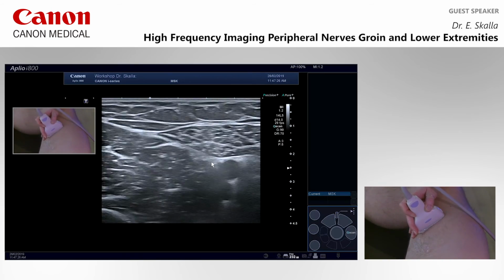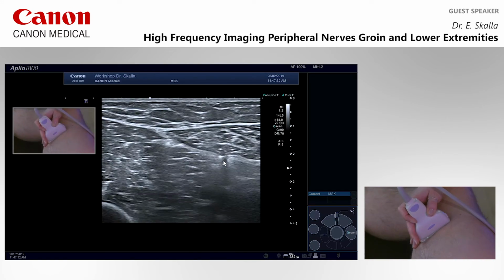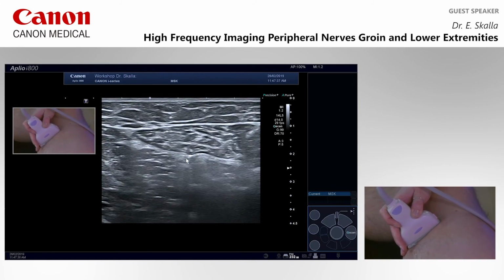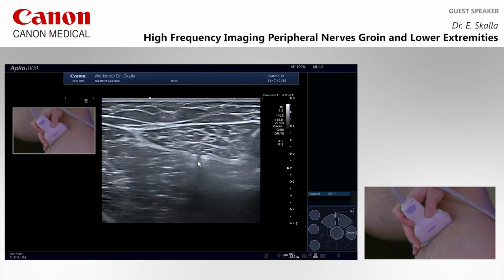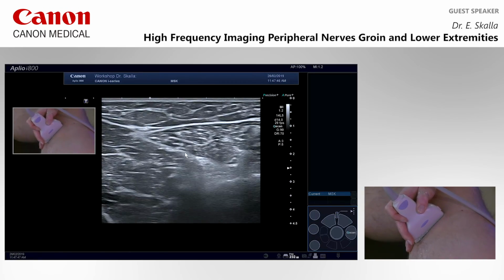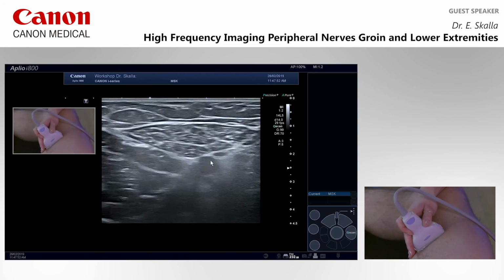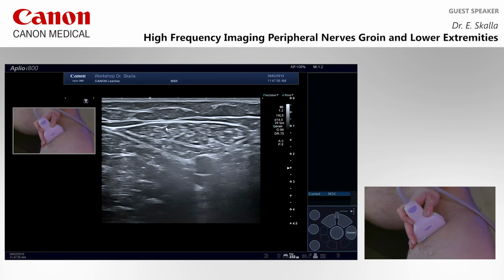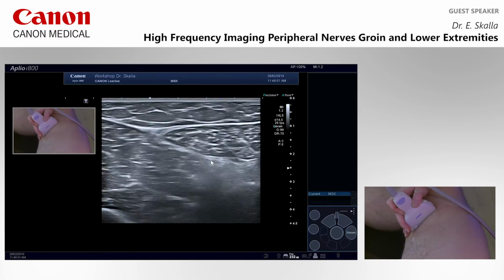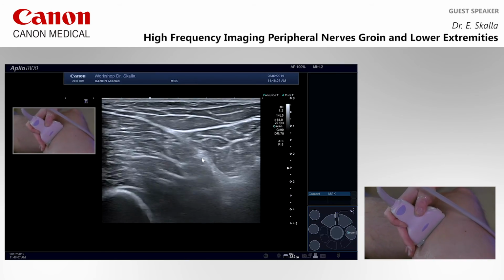Now we're going to the distal third, and here we saw the arteria genus descendens, piercing the vasoadductor membrane here, in this position, and here also the nerve pierces the membrane, as you have seen it yet. And here is a small branch which we could follow to the knee. It's the infrapatellar branch of the nerve. Once again, here the vessels, Sartorius muscle, and then it's not very hard to find the saphenous nerve and follow it downwards. Here's the nerve after the penetration of the vasoadductor membrane.